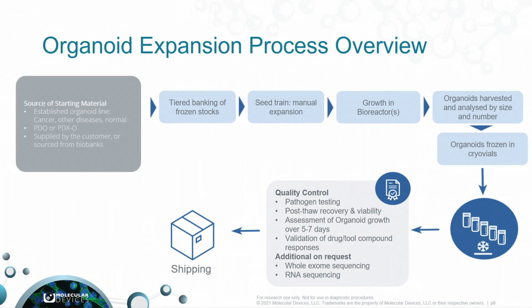The other thing that we've really developed that sits behind this, which often gets forgotten but is really important, is a robust quality system. And so that really just ensures that everything is done to the same level of quality, all of our reagents are traceable, and then also means that we have a robust method for quality control of the end product to make sure that what we're producing is fit for purpose and every vial in the batch is the same.